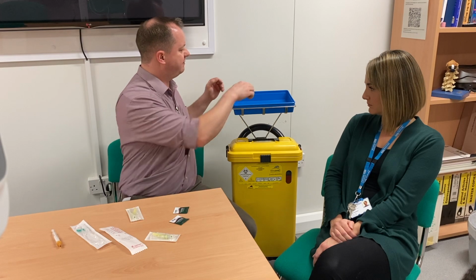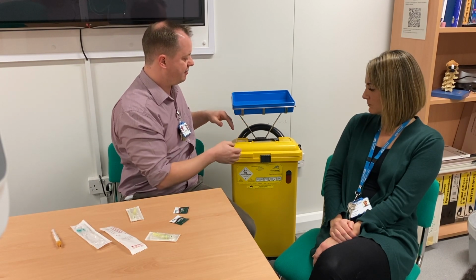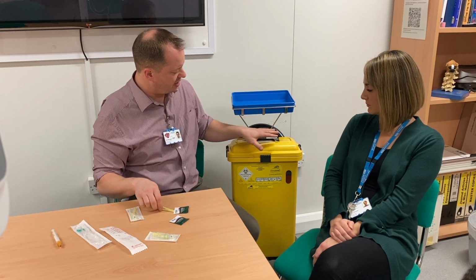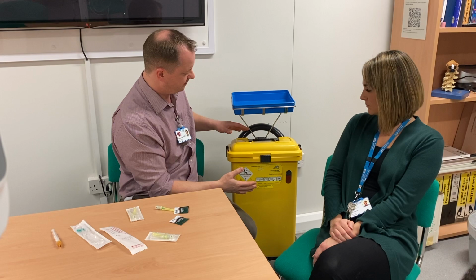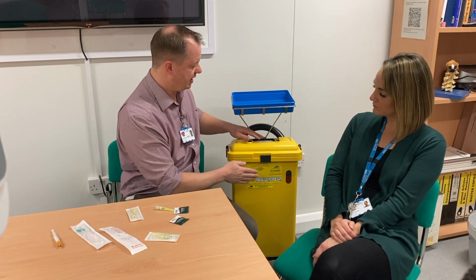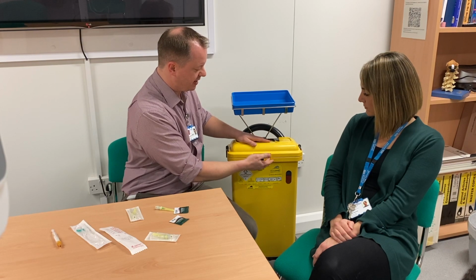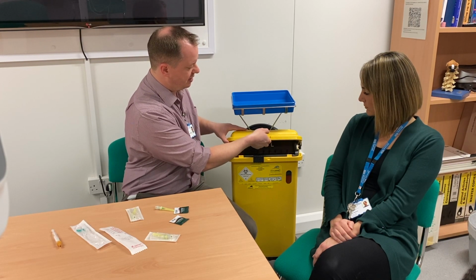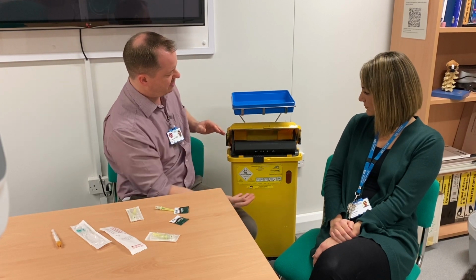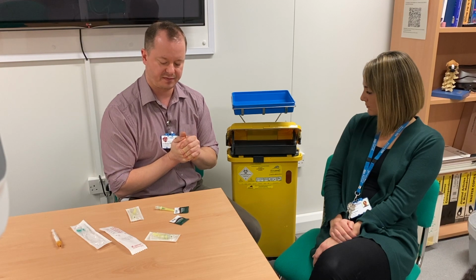They have these convenient trays on the top on which you can place all your equipment, so that's really nice. When you collect the trolley, when they're not used on the ward, they should be closed in this position. When you want to use it, it's important that you pull the catch at the front back to reveal this little lip where you can put your finger, and then when you open the trolley, the tray will open and you'll have a place where you can place all of your sharps.